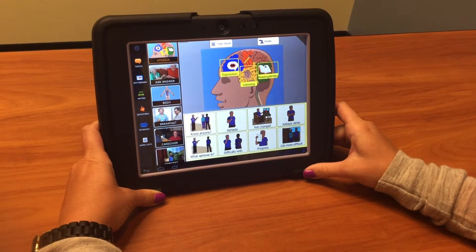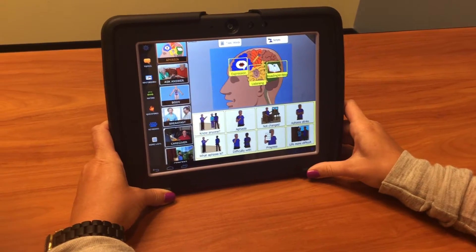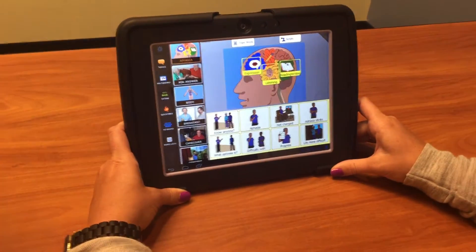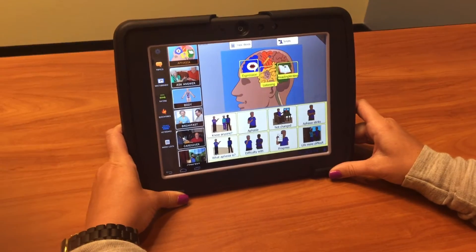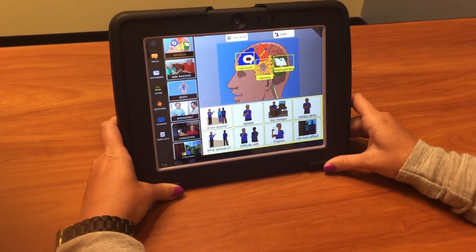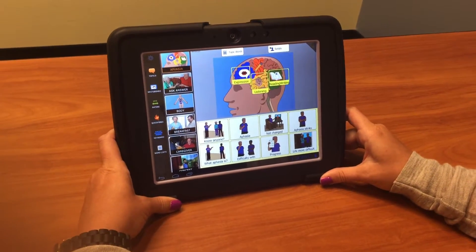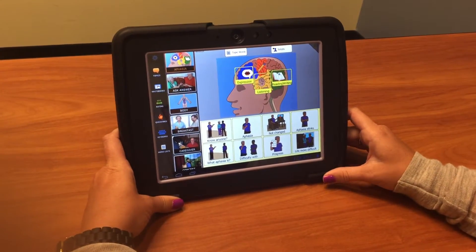This is the Dynavox T10 with Compass software by Tobii Dynavox. It can be used for children or adults with all different disabilities.